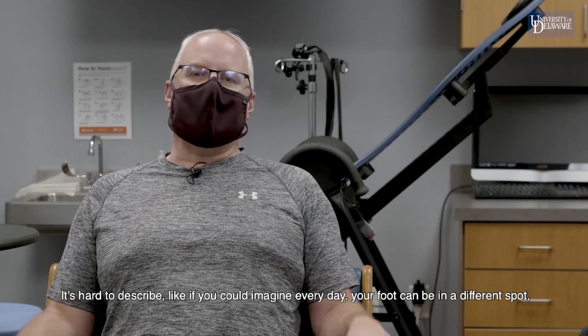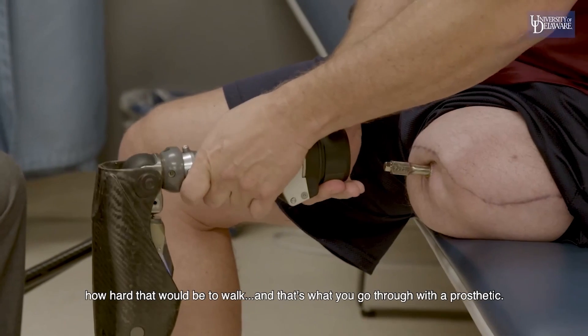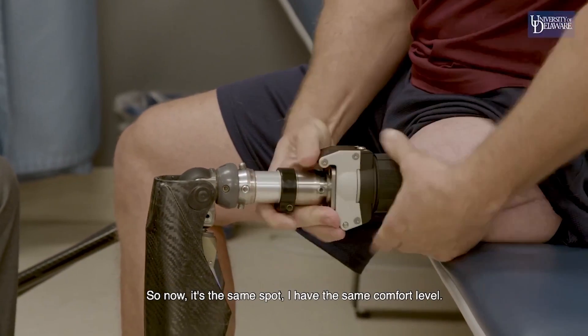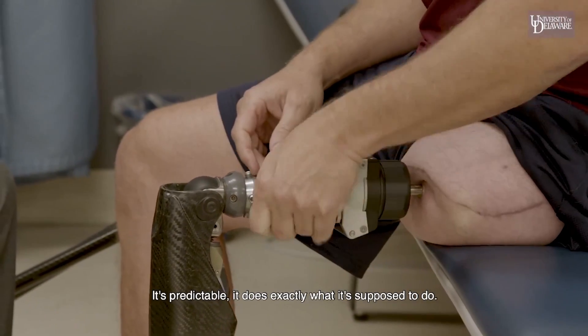It's hard to describe. If you imagine every day that your foot could be in a different spot, how hard that would be to walk — that's what you go through with a prosthetic. Sometimes you put the leg on and it's jamming into you. Now it's the same spot every time. I have the same comfort level. It's predictable. It does exactly what it's supposed to do.